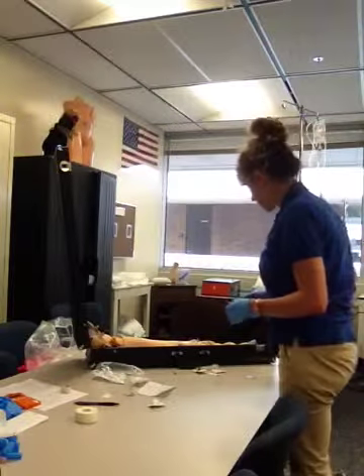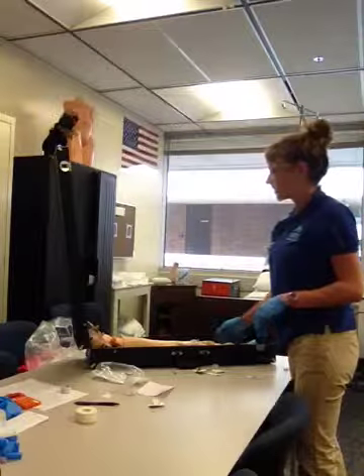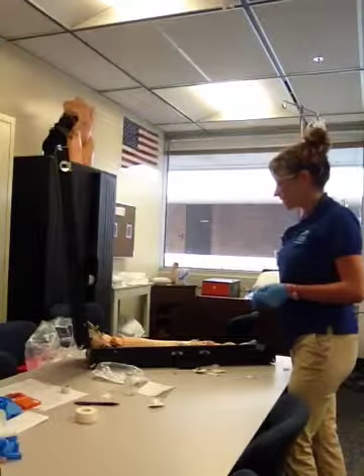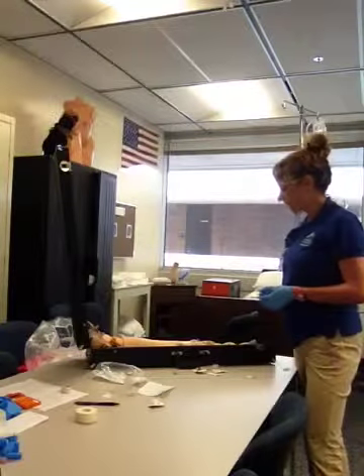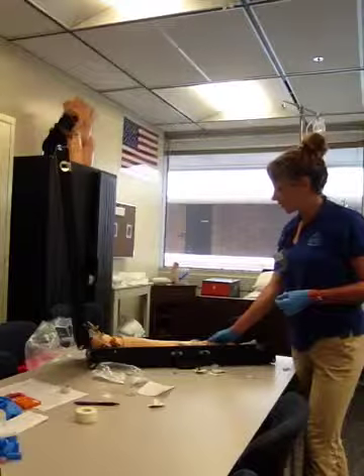Then I'm going to ask if Mrs. White is comfortable, and once again reassess for any signs of allergic reaction or side effects or adverse reactions such as skin rash, signs of anaphylaxis. And Mrs. White looks like she's in good condition, and I will ask her to call me if she needs anything or if she has any pain or drainage at her IV site.